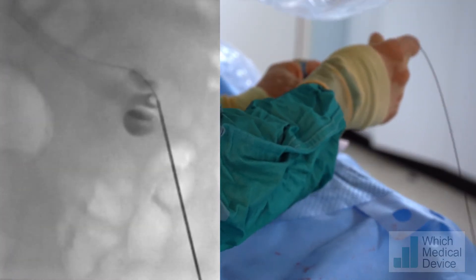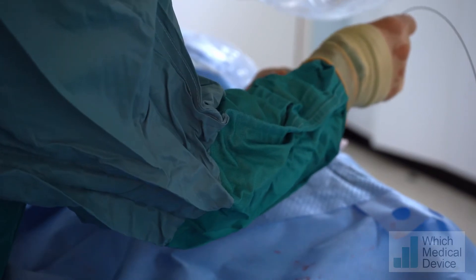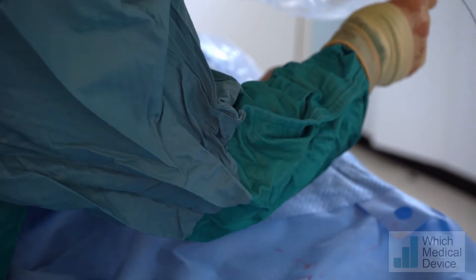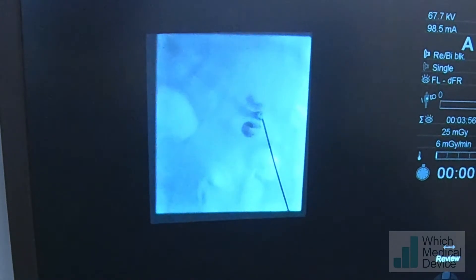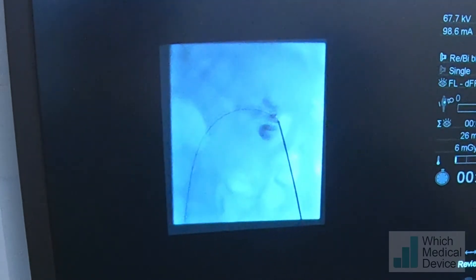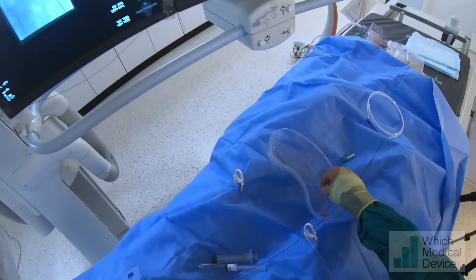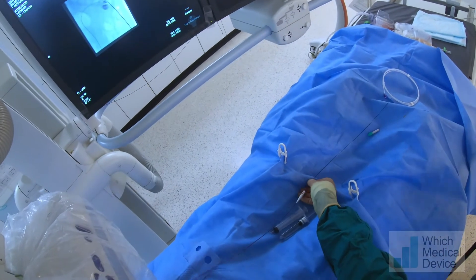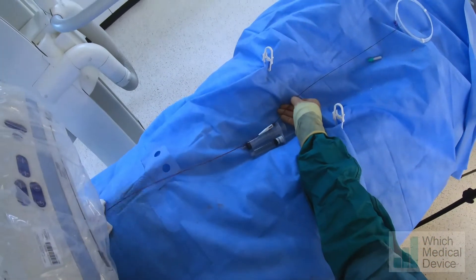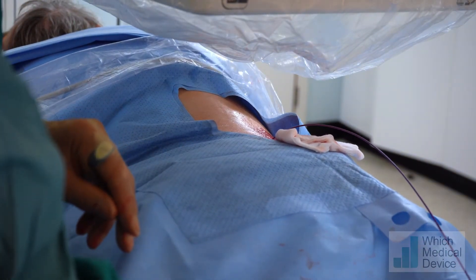That wire has gone across to the renal vein. If you're in the renal vein it means you're absolutely right next to the collecting system, as you can see on the fluoro. We're going to pull that needle back slightly to see if we can get it to just drop down into that collecting system. There we go — we've just popped through the tip of the calyx and down the dilated ureter. We're now going to pop an angled catheter in there and do exactly the same as we did on the other side.